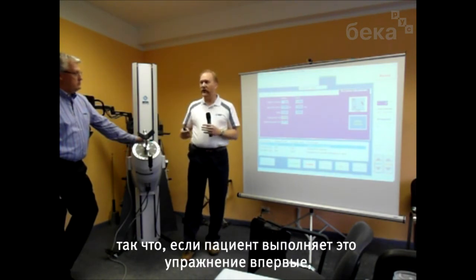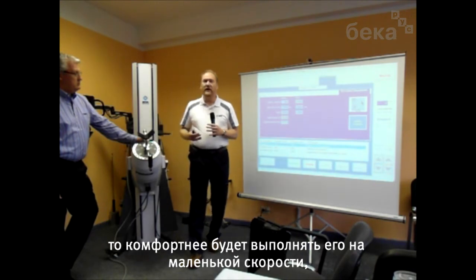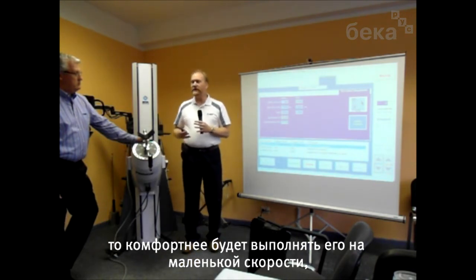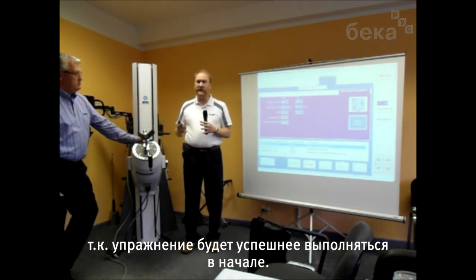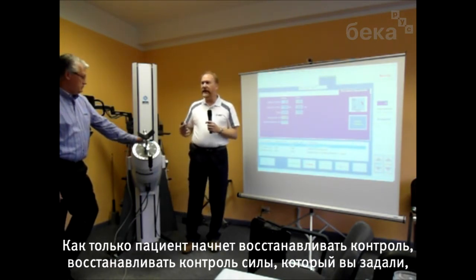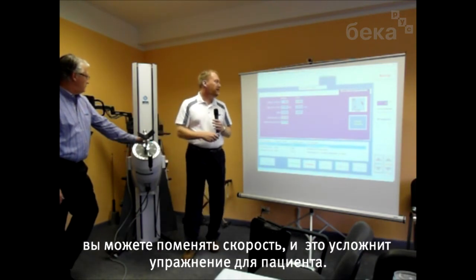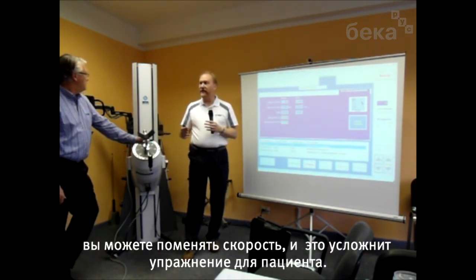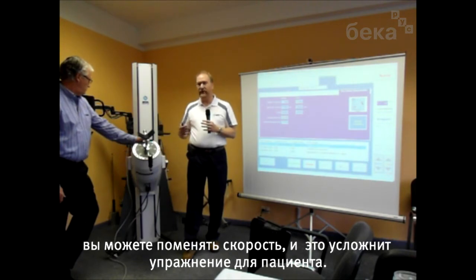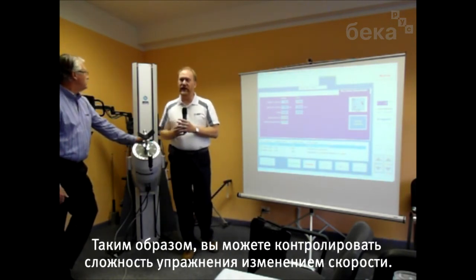So when you start working with the person the first time or the first few times with this type of exercise, it's more comfortable to start with the slower speeds because it will help them be successful when you get started. As they start regaining control and regaining that strength control that we're focusing on, if you change to faster speeds, it makes it more challenging for them. It's more difficult for them. So that's one way you can vary the difficulty of the exercise, by changing the speed of the exercise.